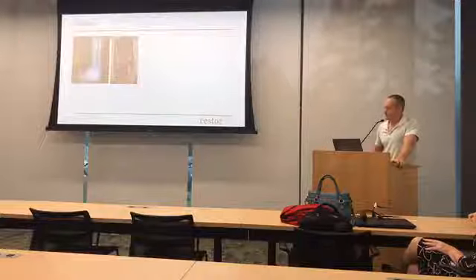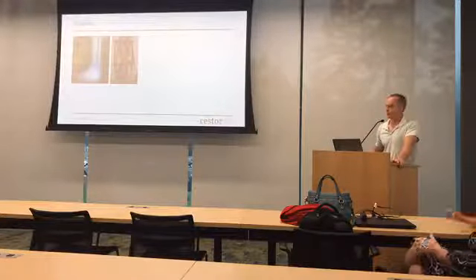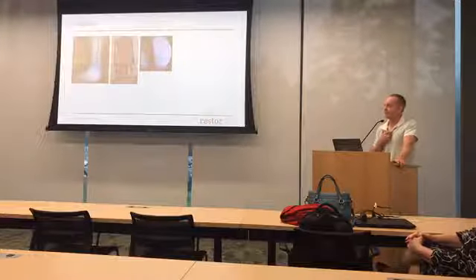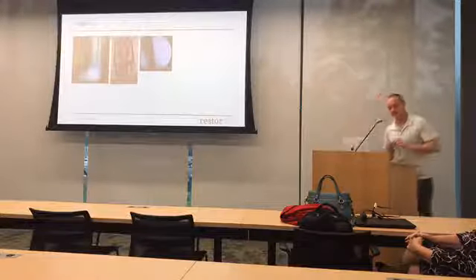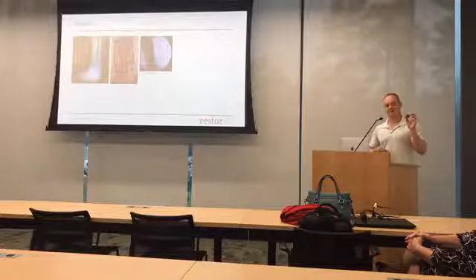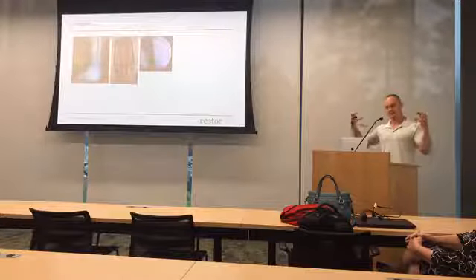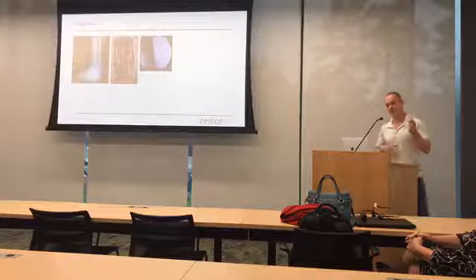So rather than do this, we brought her to Duke and used our company Restor3d to build her a new bottom half of her tibia out of titanium. And we can build it out of a scaffold material. I'll pass this around. It can hold about 10,000 pounds and also is 85% porous. It's printed out of titanium, and that allows the bone to grow through this and rebuild her. She can then rebuild her own leg.